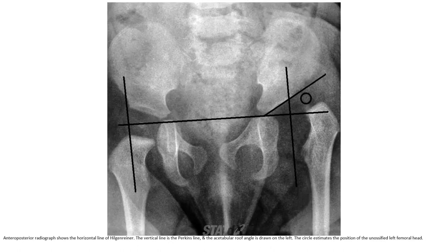Anteroposterior radiograph with the horizontal reference line is shown. The vertical line is Perkin's line, and the acetabular roof angle is drawn on the left. The circle estimates the position of the unossified left femoral head.